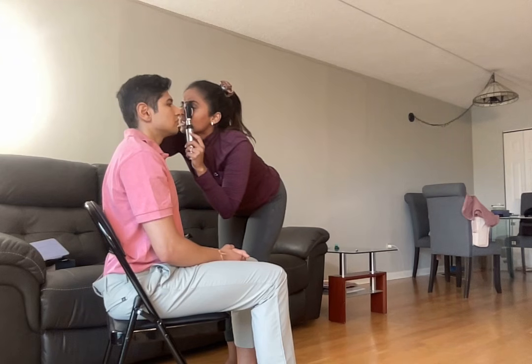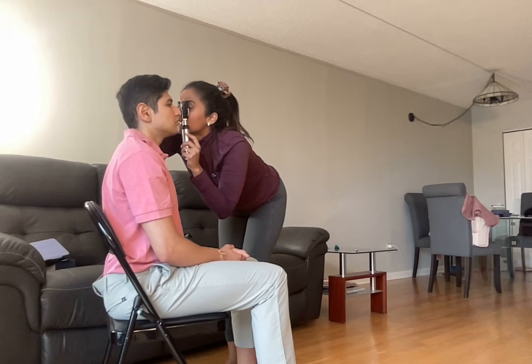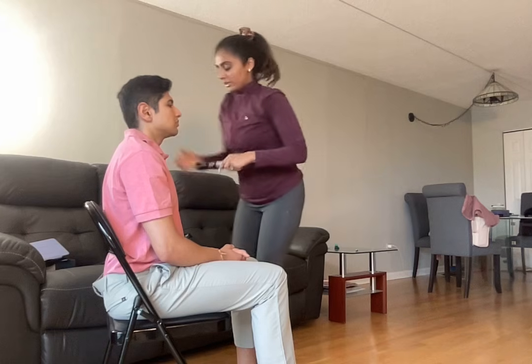I'm going to do the same on the other side, at a 15-degree angle. I see the red reflex. I can see the macula, fovea, and optic disc. No macular degeneration noted.